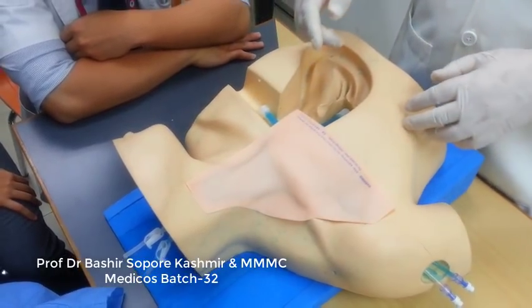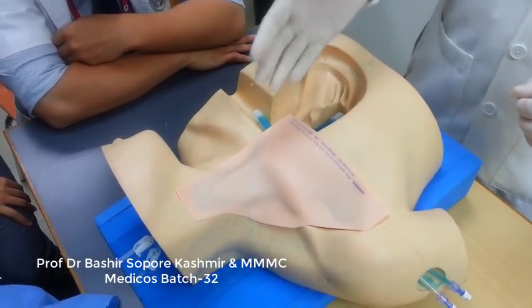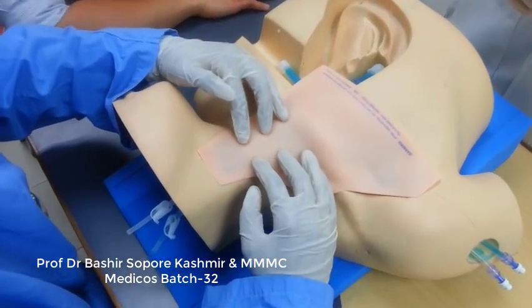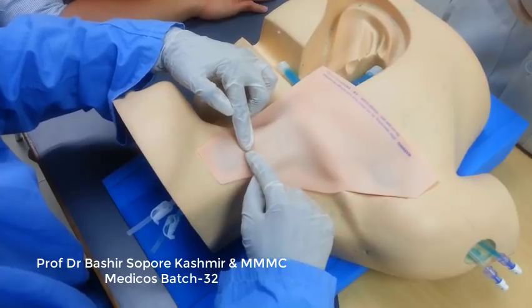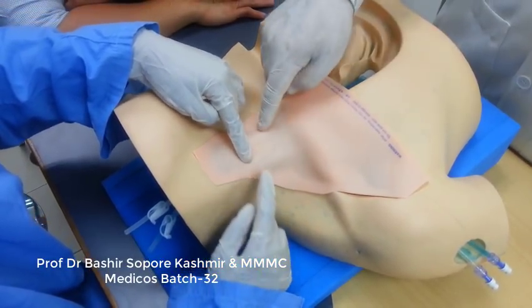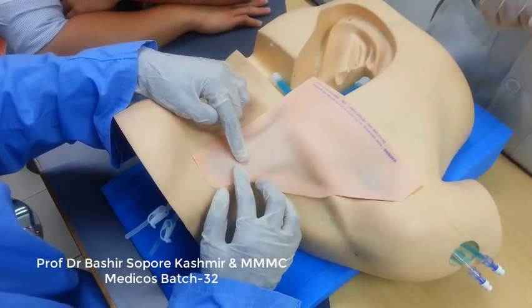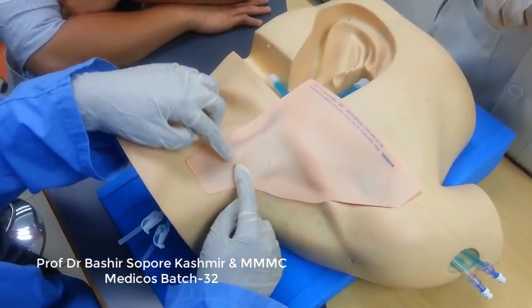Then the second approach is what is called the central approach, which is what you are going to show us. So show us the central approach. The central approach is when you find the 2 heads of the sternocleidomastoid. Then you identify the apex, where the two ends of the sternocleidomastoid meet. That is where we insert the needle, at the apex.